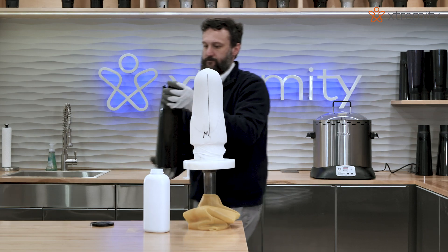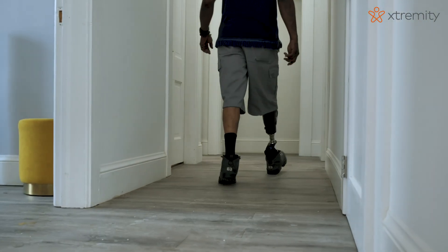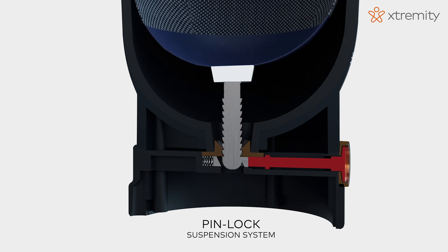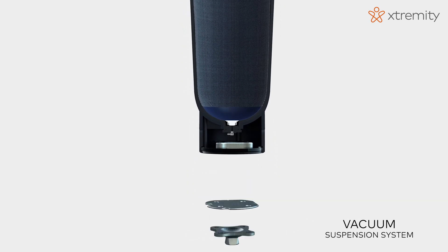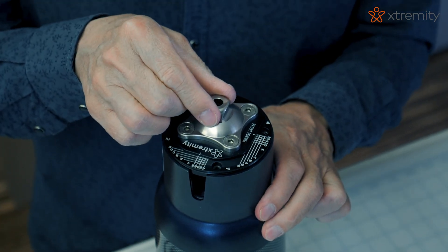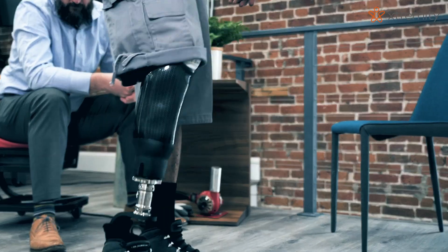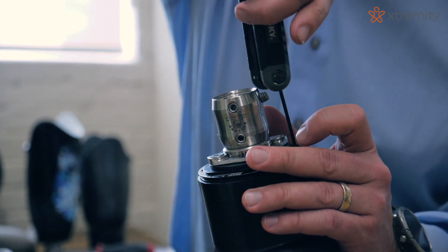The idea that we have a structurally sound, easily formable plastic incorporated beautifully with all these components — I can use suction, pinlock, or vacuum, and it's all just so easy. To be able to change those systems is something that's never been done before in any prosthetic socket. We have a built-in alignable system; you can slide the distal attachment plate in any direction to account for any alignment needs. It uses the same four-hole and pyramid systems that we've always used.